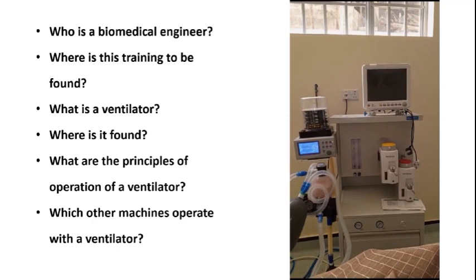And then we are able to also know which other machines need to operate hand in hand with a ventilator. So there's a whole range of equipment or knowledge behind the scenes. So when you visit the medical facility or a hospital next time, look out for a ventilator.